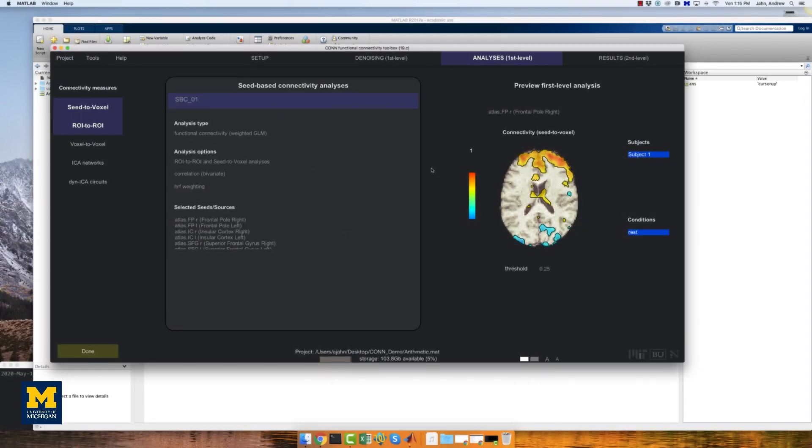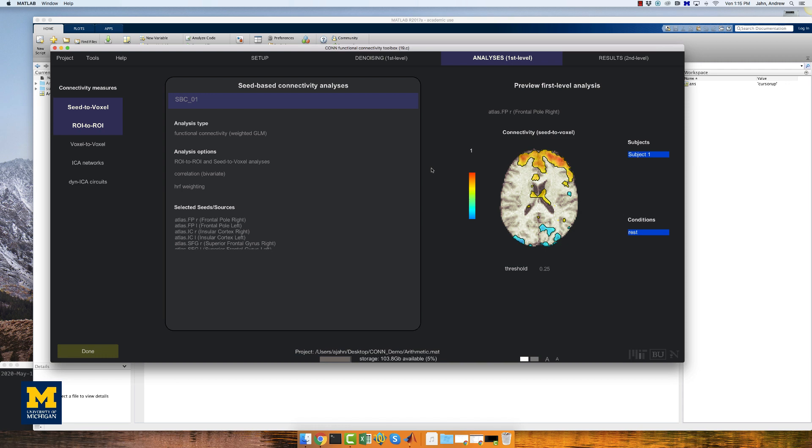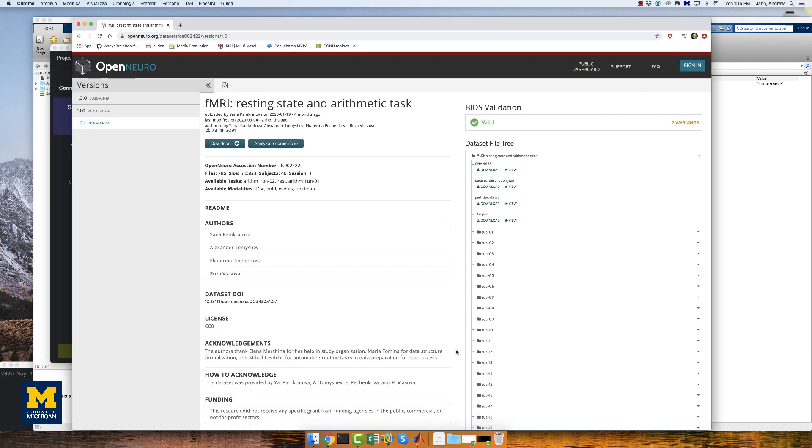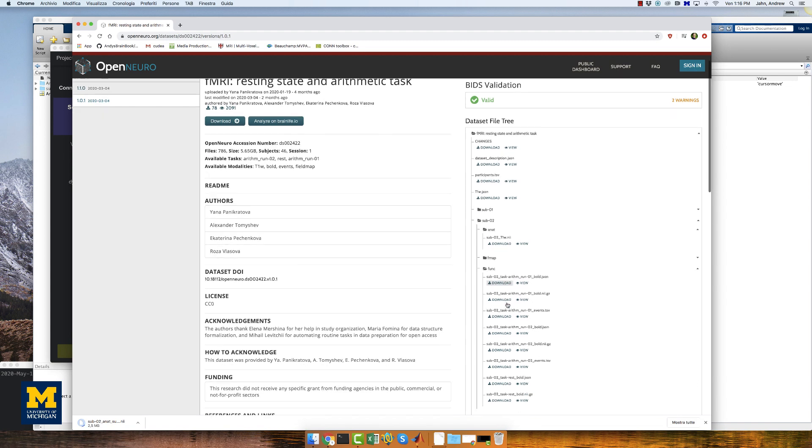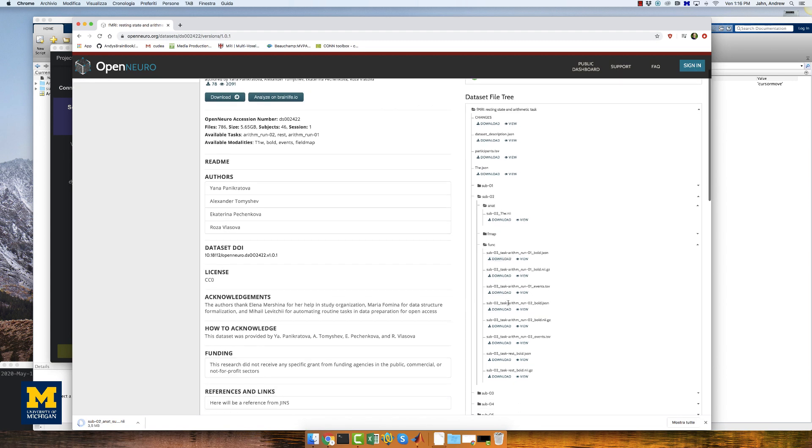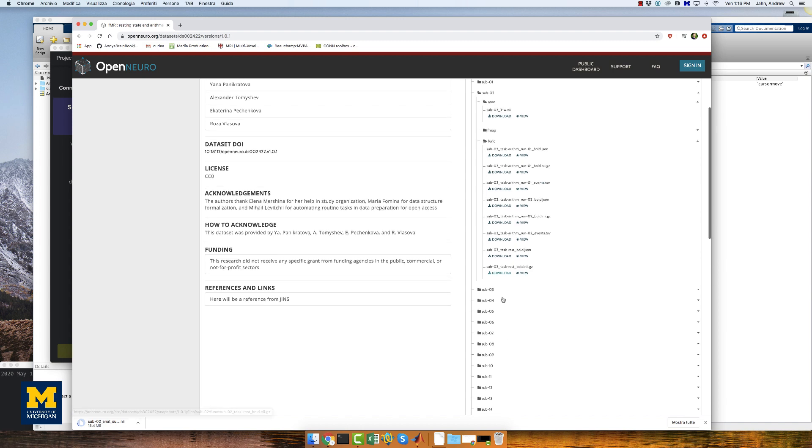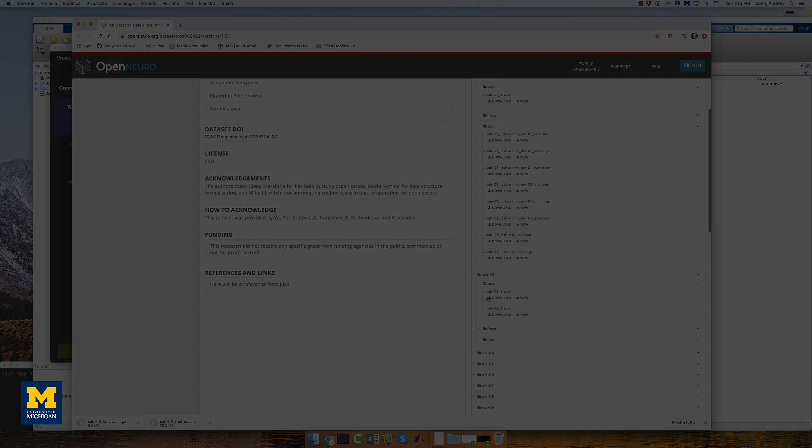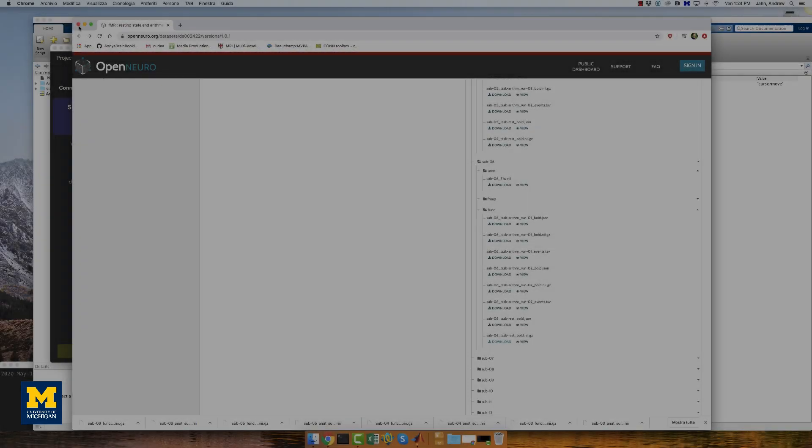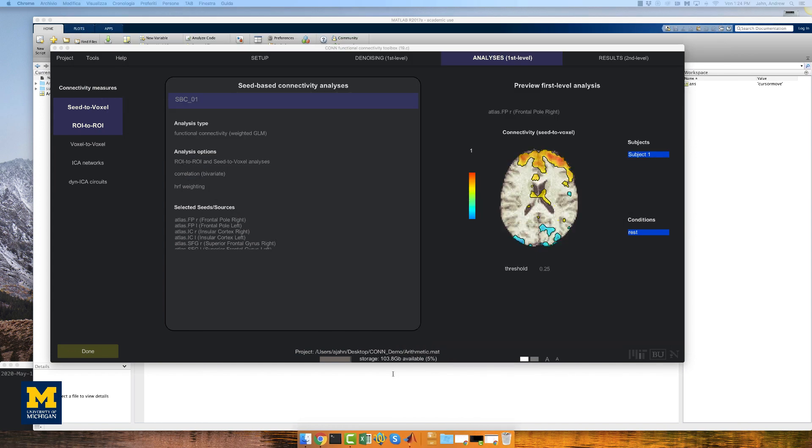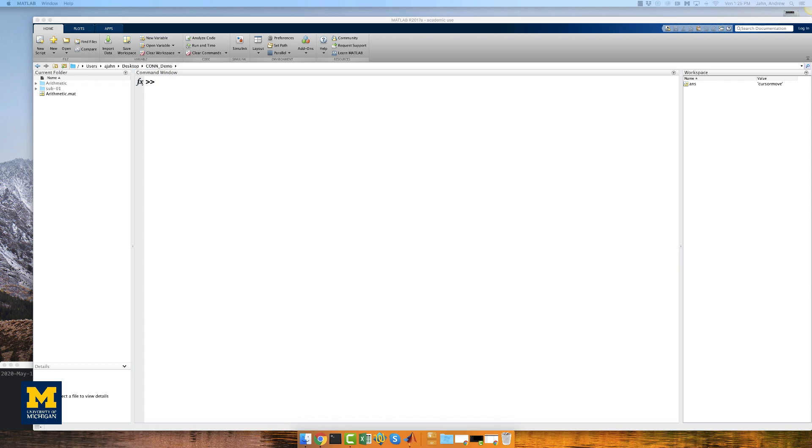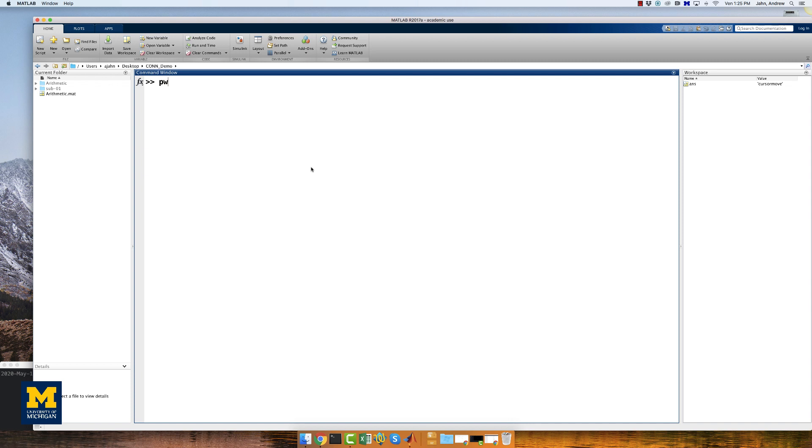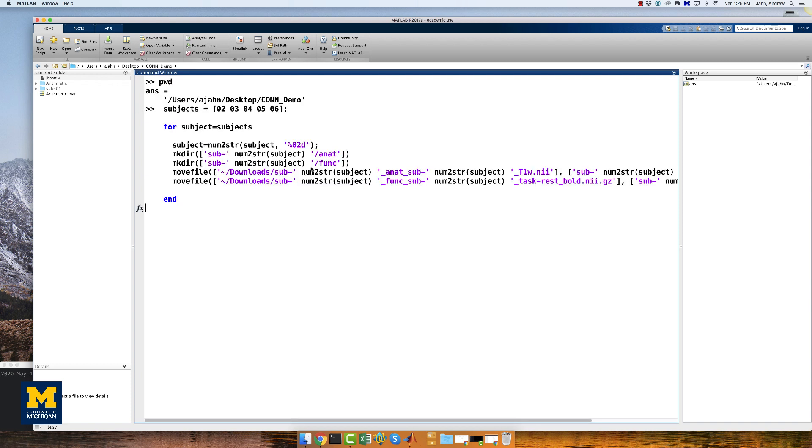To load more subjects, we will first have to download more subjects. Go back to the arithmetic study on the Open Neuro website and download the functional and anatomical data for subjects two through six. This will take a while, so I'm going to speed it up, but after you do just a couple, you should be able to get the basic pattern down. If your downloads folder is the default, you can move all of the downloaded images to the respective folders by navigating to the arithmetic directory and copying and pasting this code, which you can find in the information box down below.